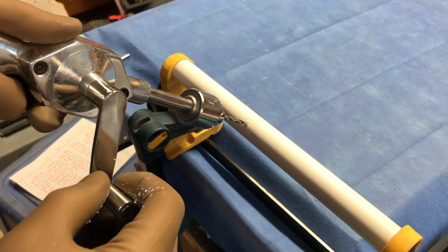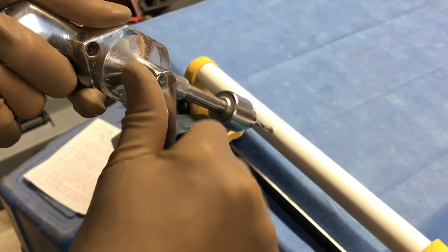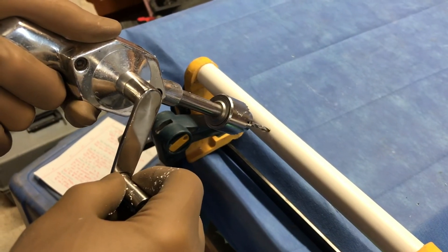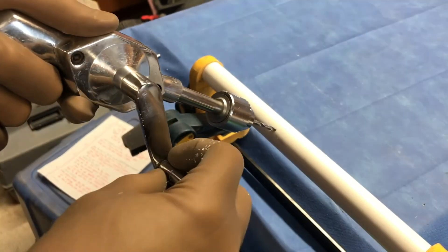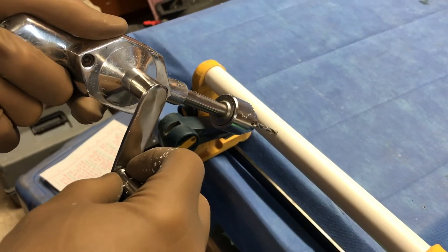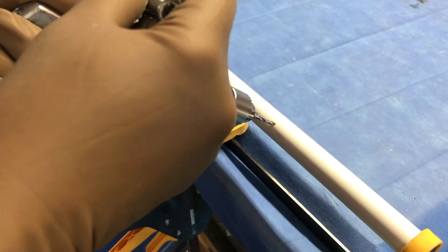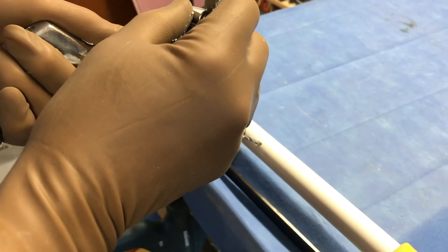Technical skill number four: as you're drilling through the cortex, you'll feel it drilling, and there's a moment where there's some increased resistance as it plunges through. Sense that increased resistance and be careful not to plunge. At that point, you slow up the rate of drilling and back off on the amount of pressure so you don't suddenly plunge through. Feel for the grip of the bone at the tip of the drill as it's about to pass through.